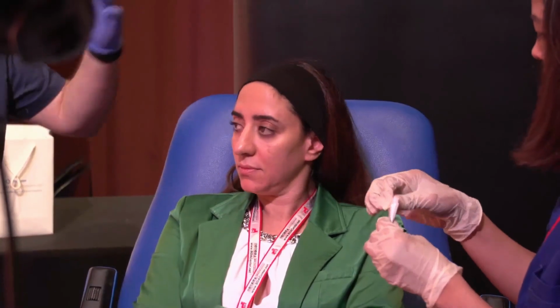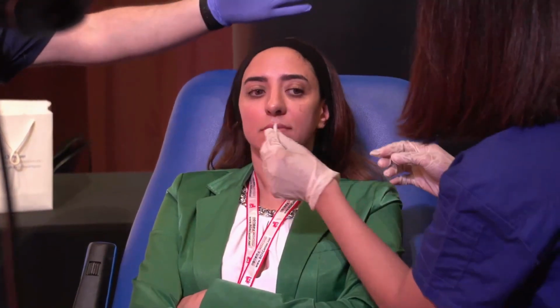I'm left-handed. I usually inject the lips from the left side. The face, if I injected the first model on one side, I usually go to the other side. It's very hard to inject from one side all the products. You can't assess the anatomical area very well.